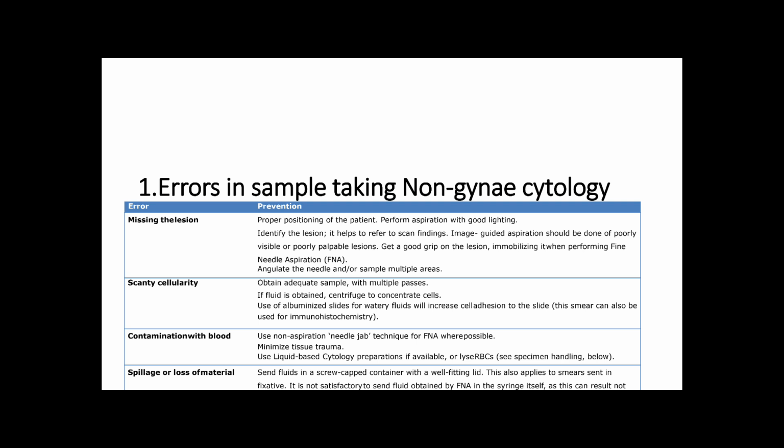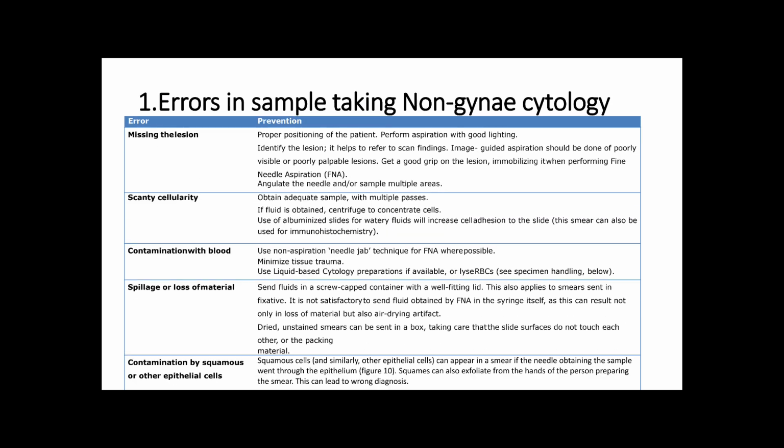So, when we consider non-gynecological cytology, first is missing the lesions. How to prevent: prepare and position the patient, perform aspiration with good lighting, identify the lesion.